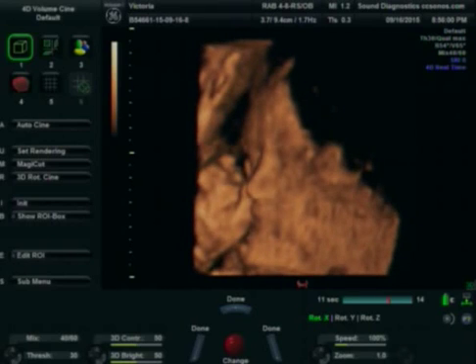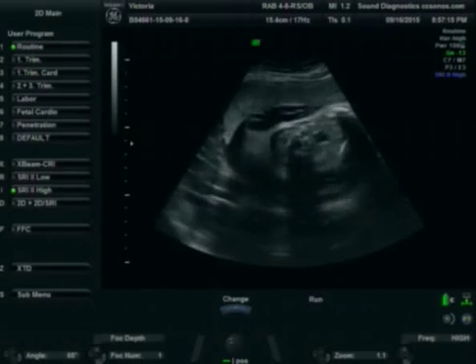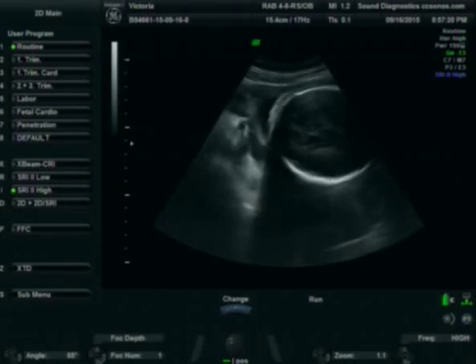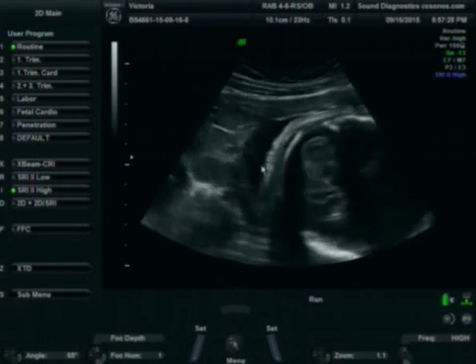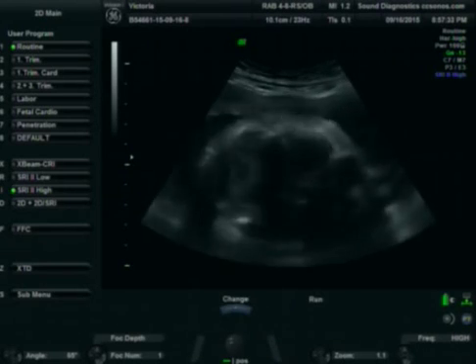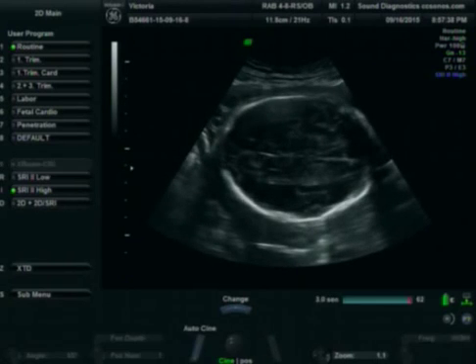All right, let's look around and see what else we can see in there. So the head is straight down in the middle here, face more towards your left, means the back side of the head is this way, a little bit more towards your right. This is how we look for hair. That's the skull, then the scalp, and you see it's just a little bit of a bumpy line right there. I mean, that is the thinnest of peach fuzz. So she's going to be bald. Pretty much, yeah. Still some time for the baby to grow some hair, but as of right now, there isn't much there.